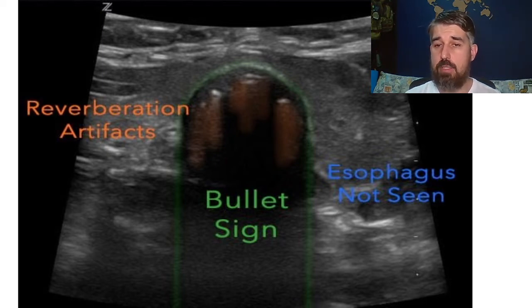And when we are looking at it, we don't see the esophagus. It's a virtual cavity. It's always one wall sticking with the other, and just when you are swallowing something, it will pass, but the walls are always touching themselves, so we don't see air in it when we are probing it. So that's the image we want to see.